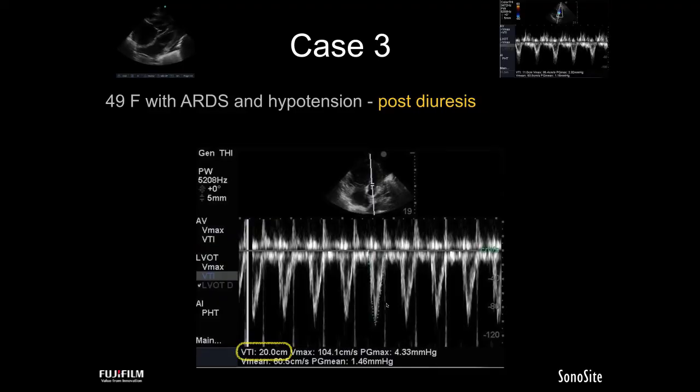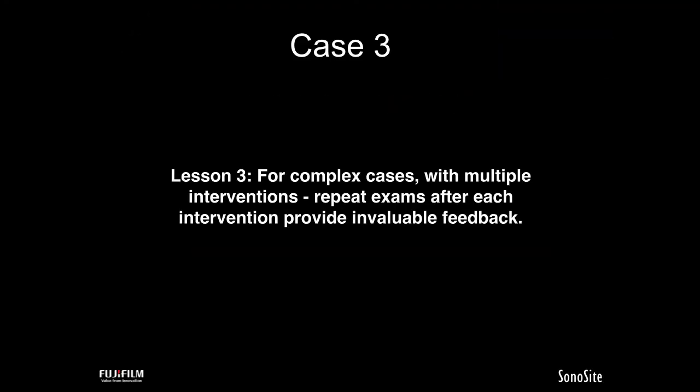And so it's so gratifying to be able to have an objective case scenario that highlights this. And I must give an acknowledgement to one of the trainees at my center, Dr. Vincent Lau, who obtained these cases, and he's an outstanding echocardiographer. And so he's captured the result of this intervention beautifully in this case series. So thank you, Dr. Lau.